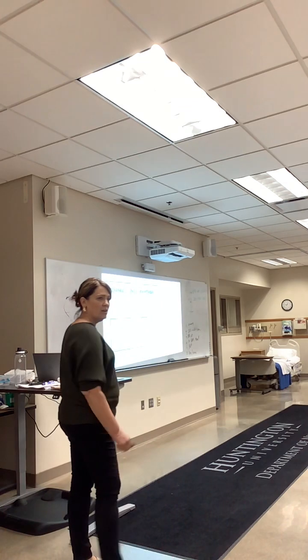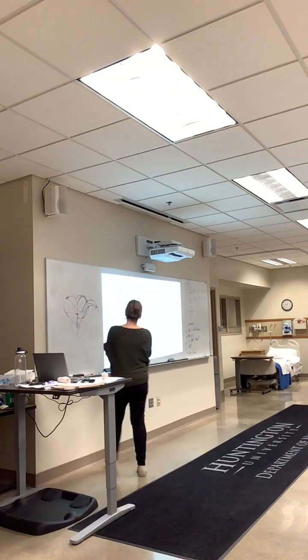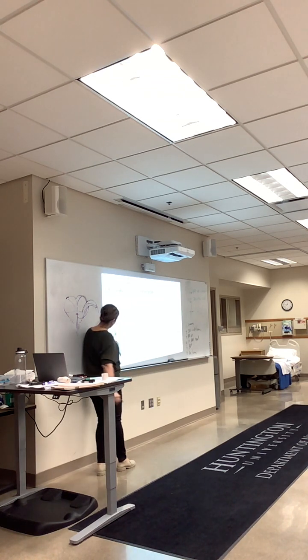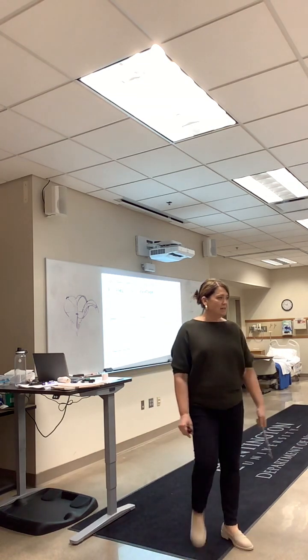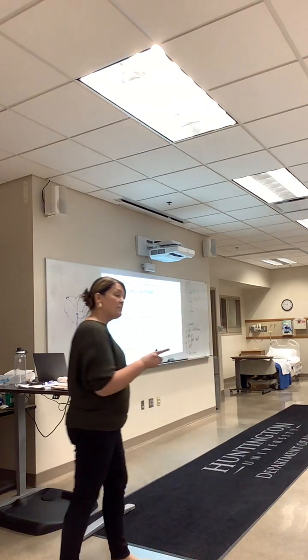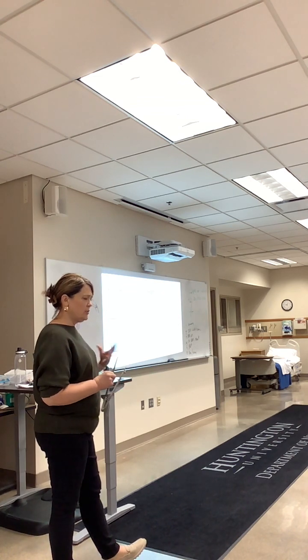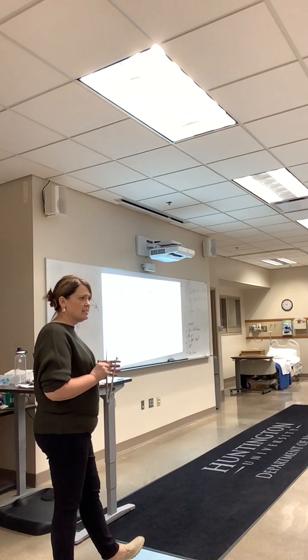Didn't you say that it was a narrow QRS? That is a narrow QRS. But it's still normal? Sorry, I'm about 1.5 boxes. I didn't go the whole way over here. I should have. Does that make sense? Do they do this in real life, or is it something online? They do. You can do it online, but always double check because it's not always right. A computer will read it to a degree. And then there are other times you need to check it and read it outside of that. I know, sometimes it depends.